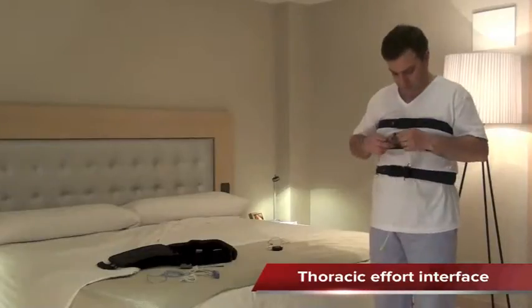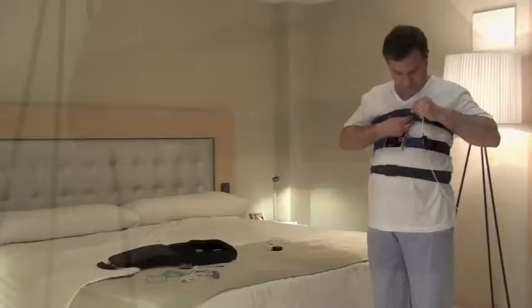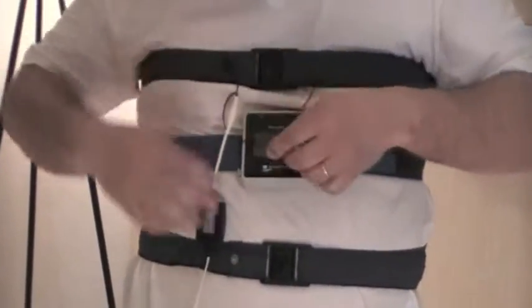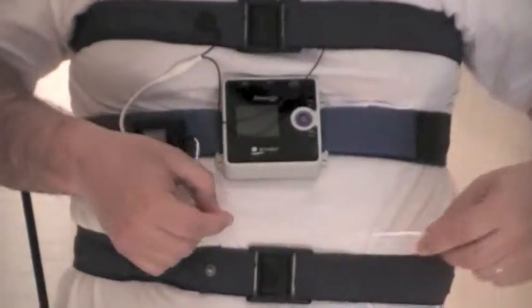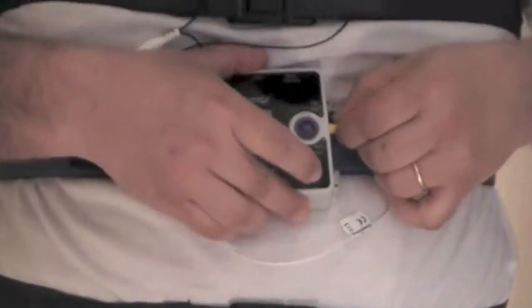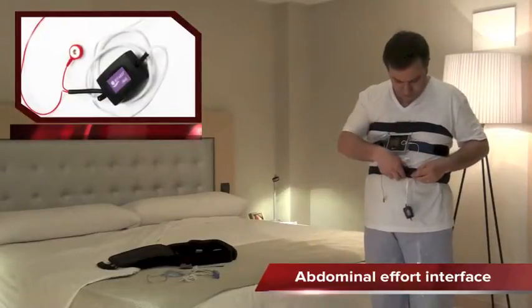Connect the terminal to the brackets of its own band. Hold the box over the thoracic band with the velcro and secure it with the tape. Connect the boxes to the keyholes of the device, thoracic and/or abdomen. Repeat the action with the box on the abdominal band.